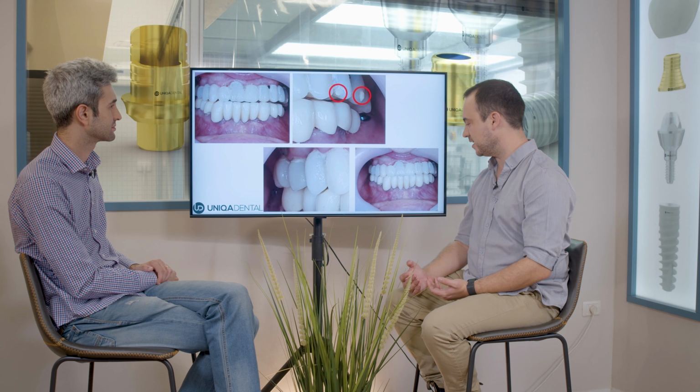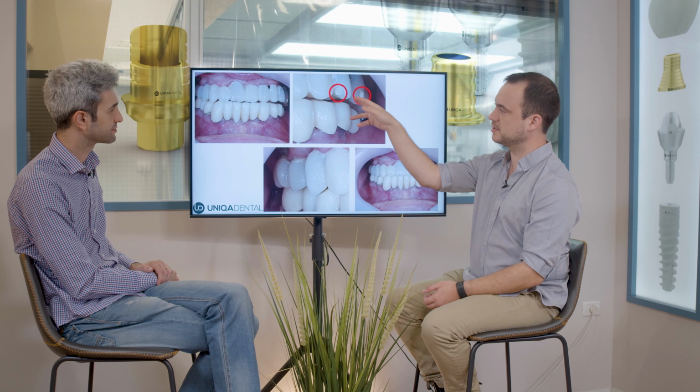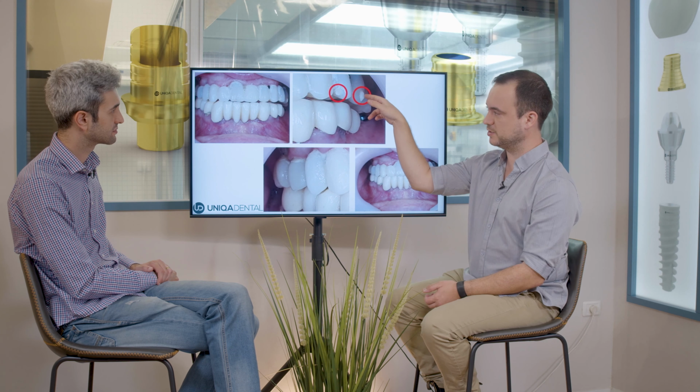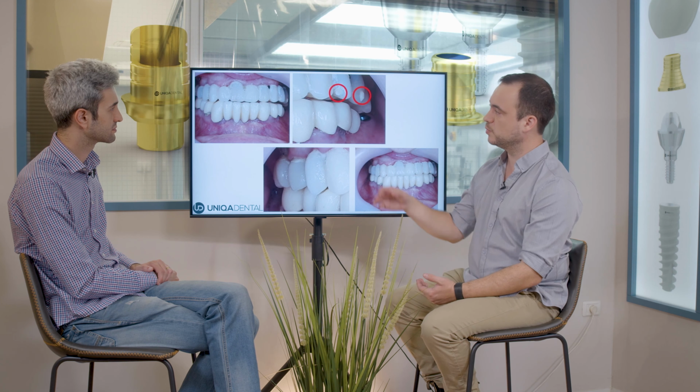Right now, it's not the ideal situation. It's not the ideal thing to see after you send the patient home and he comes back after a few months. You can see the screw channels, and the material of the screw channel is a little bit different color than the material of the original bridge. And you can see that the screw channel will go out from the buccal part. So in this case, maybe we need to consider changing the straight multi-units to angulated ones.